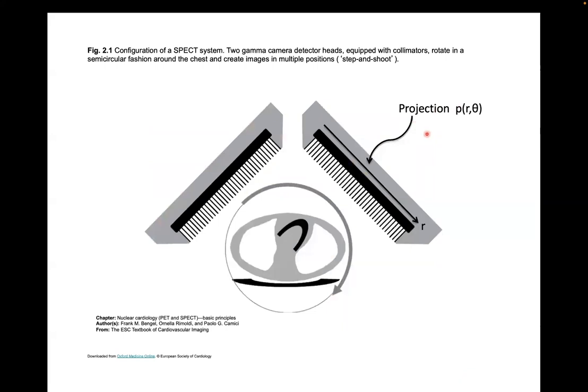We'll look mathematically at how the projection is encoded. If we have a real number along this line, which is its position along the detector from, say, 0 to 1 or whatever you choose, we create a signal, which is the amount of excitation or events that you saw as a function of position along R for this specific theta.